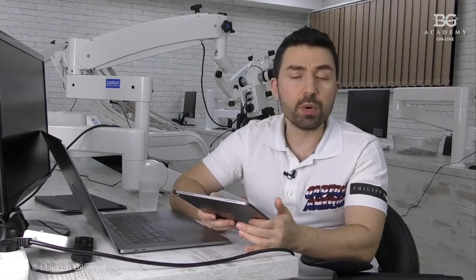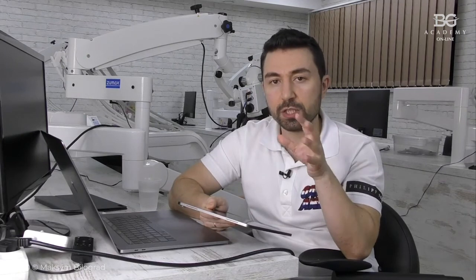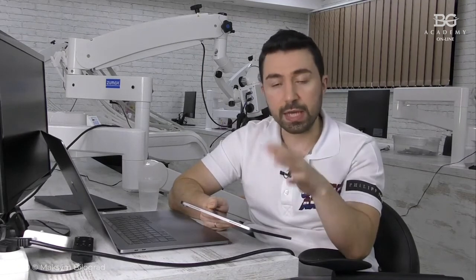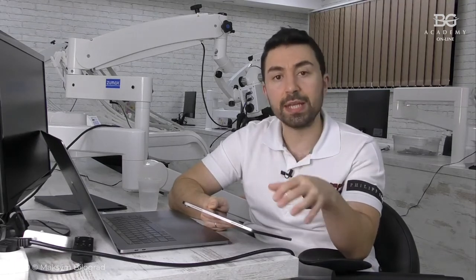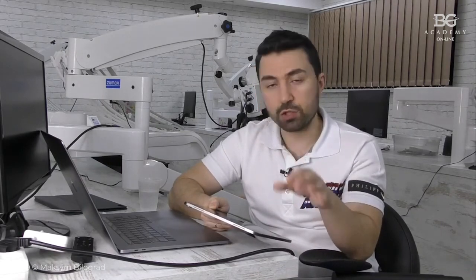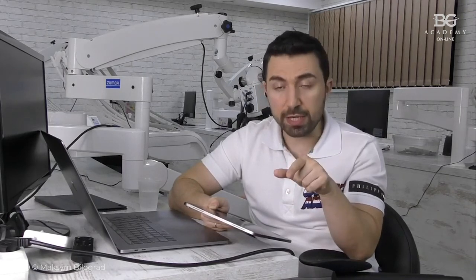Yes, we were discussing this show-out effect. If you gave enough space to your dental technician, which means before doing the case you discussed color issues with your dental technician, and your technician guided you regarding the space or thickness of ceramic restoration he has to have in order to change the color, and then you prepared the teeth considering that thickness, following all the principles of preparation, controlling yourself with depth marking burs and silicone indexes, and you are sure that you gave enough space, and during try-in you have this show-out effect, this is a problem from the dental lab.